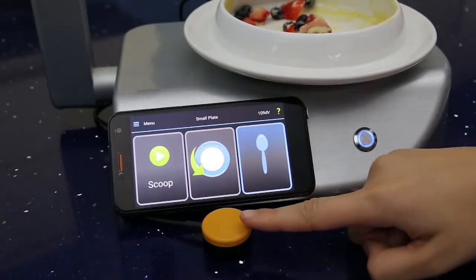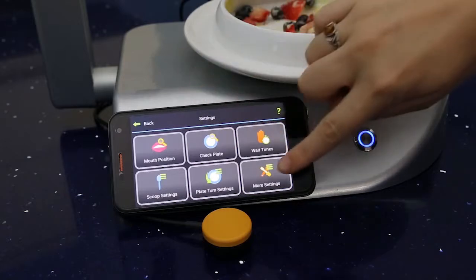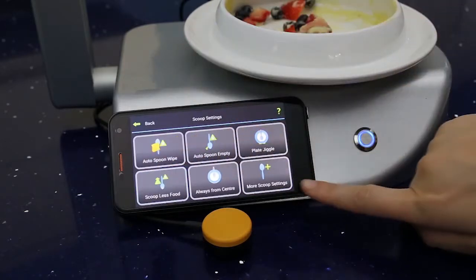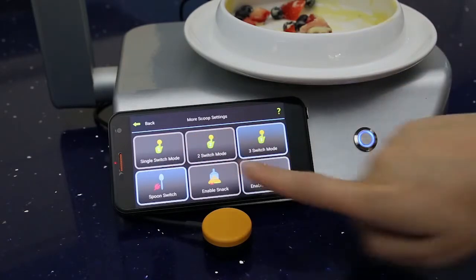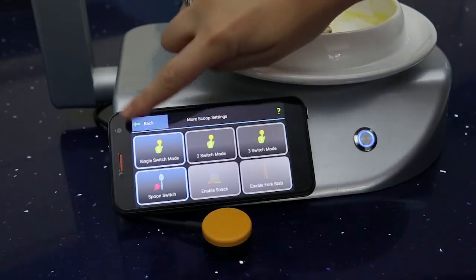For some users, only accessing one switch is the best option. So you go into Menu, and then Scoop Settings, and then More Scoop Settings, and then Single Switch Mode, yes. And then back.